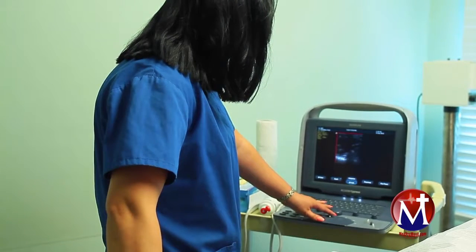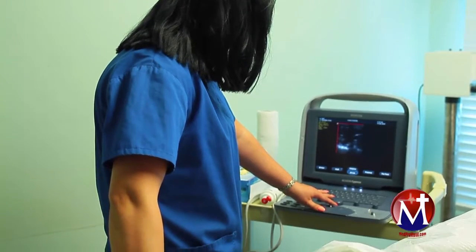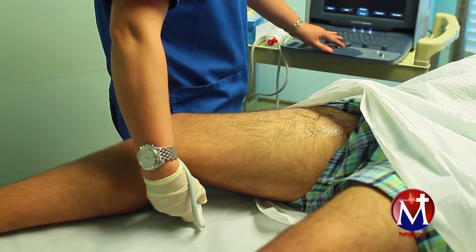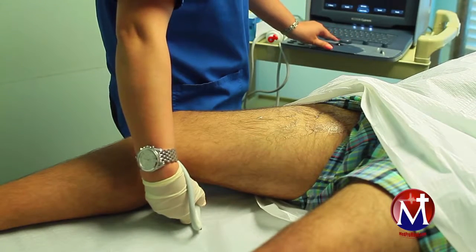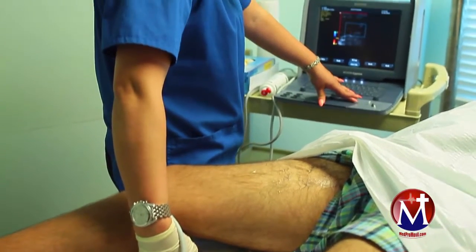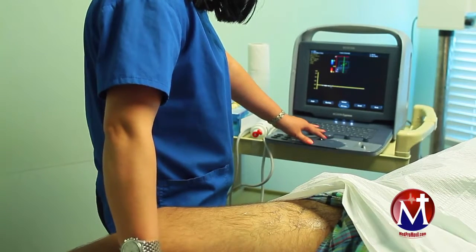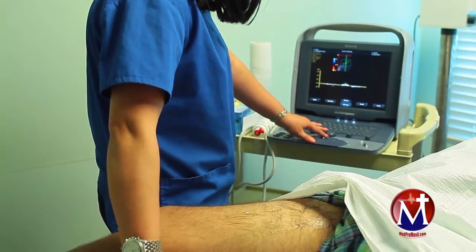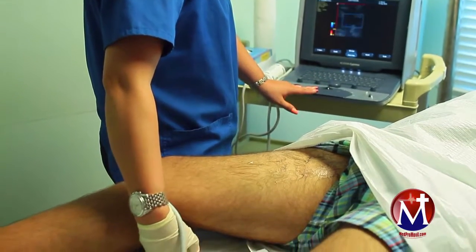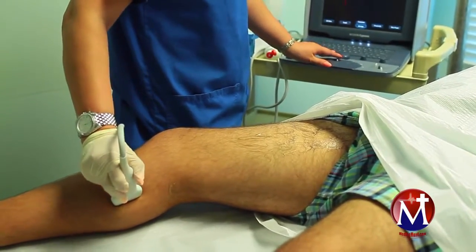Doppler interrogation of the vessels is performed to show normal phasic venous waveforms and the appearance of the waveforms after augmentation. Right now, Layla is demonstrating color flow and compression technique that is used to visualize the entire course of the deep venous system. Once again, this exam is non-invasive, does not require any patient preparation, is painless, and without the use of any ionizing radiation.